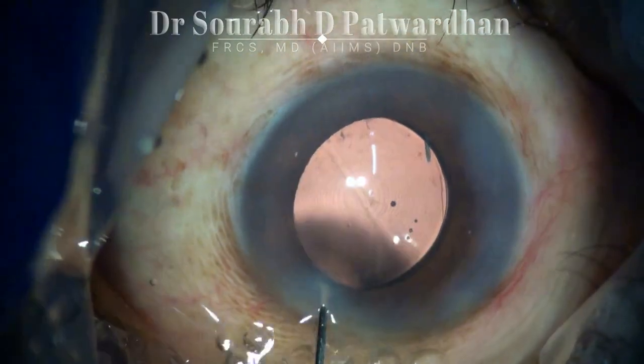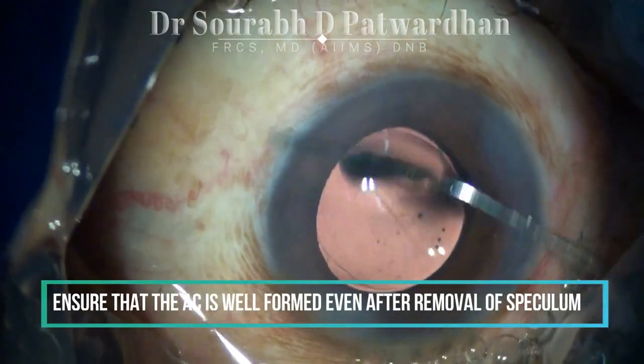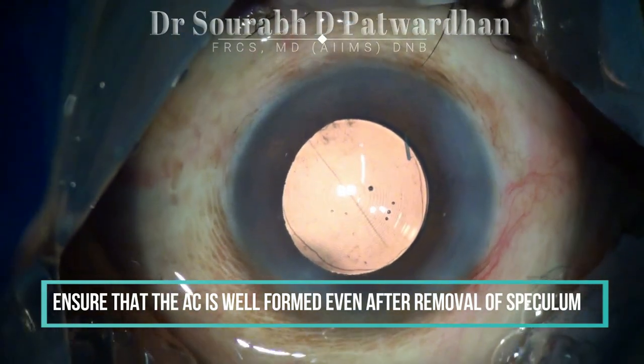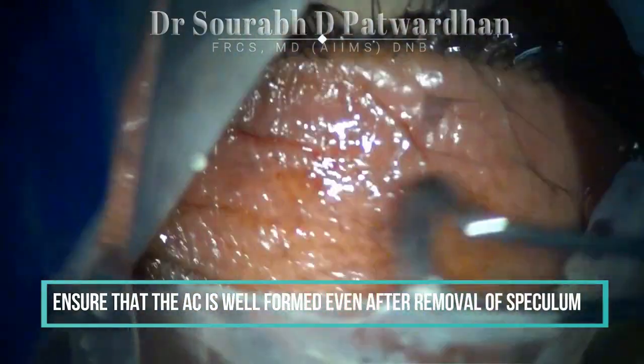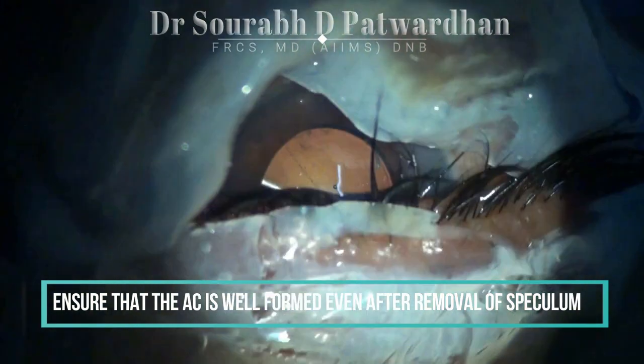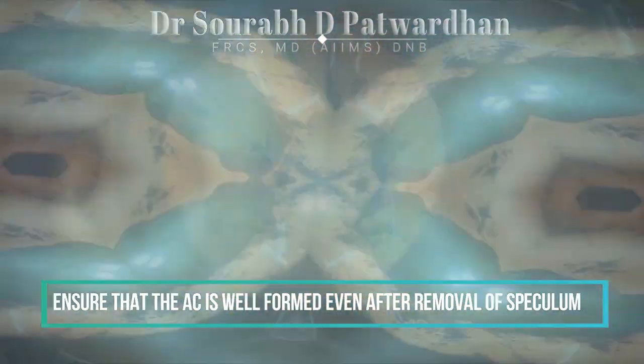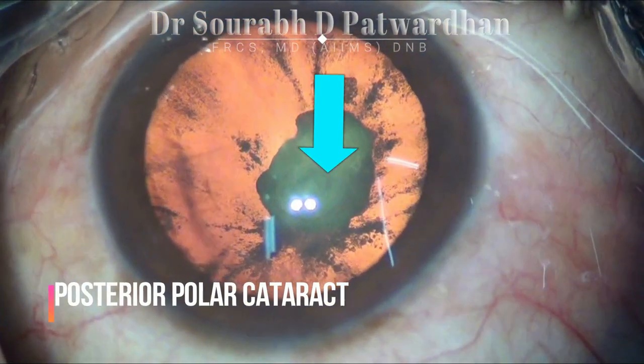Always make sure that the incisions are well hydrated and there is no anterior chamber collapse even after removal of the speculum, else it may lead to postoperative hypotony and a higher chance of infection later on. Make a habit of confirming that the AC is well formed after removal of the speculum.